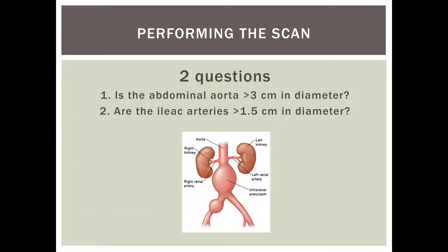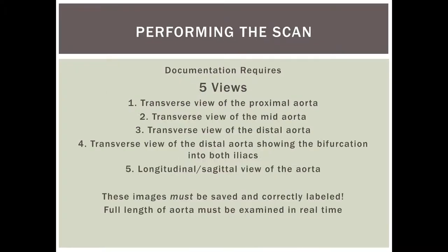When performing the scan, the two key questions are: is the abdominal aorta greater than three centimeters in diameter, and are the iliac arteries greater than 1.5 centimeters in diameter? You will obtain five views: transverse views of the proximal, mid, and distal aorta; a transverse view of where the distal aorta bifurcates into the iliac arteries; and one longitudinal view of the aorta. Remember to save and correctly label the images.